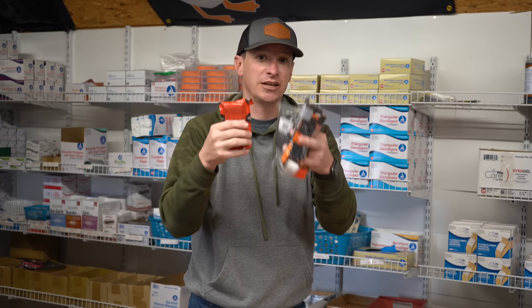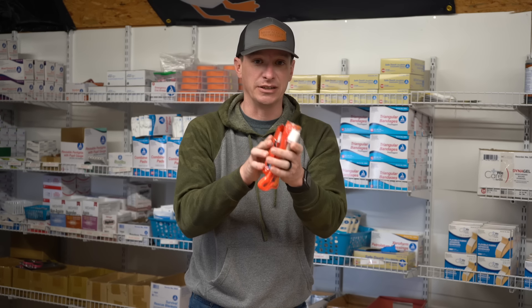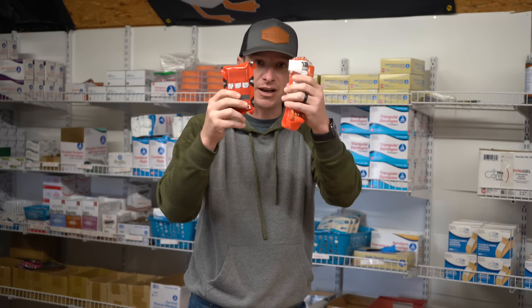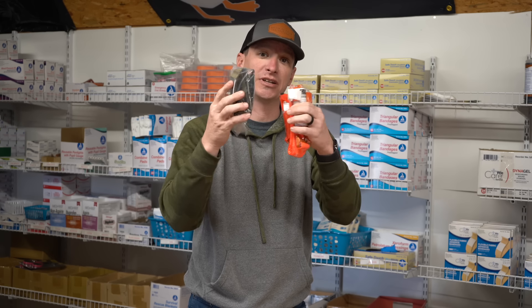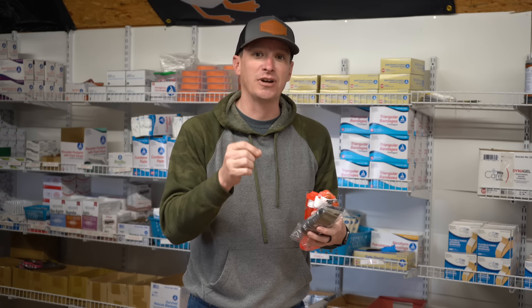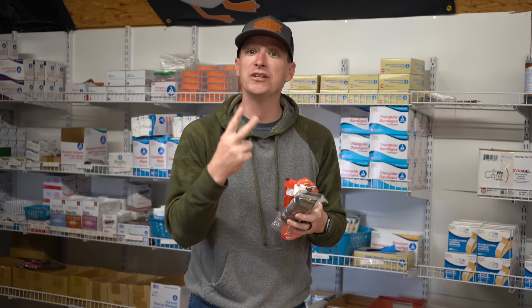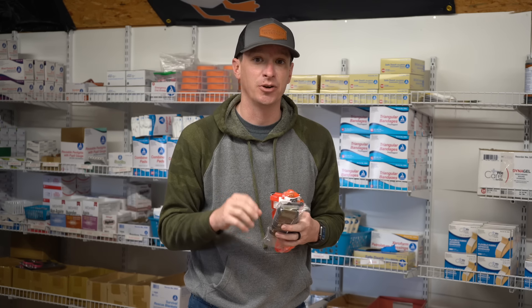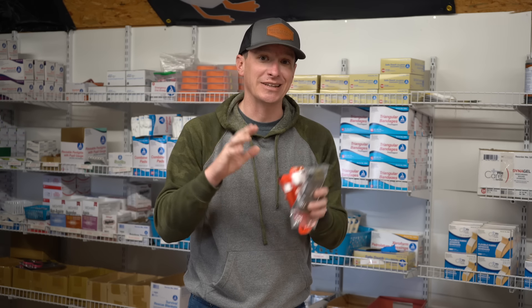Or if you want to run a combo — say a CAT and a SWAT-T — that's fine. The SWAT-T has multiple uses. I think you should put two tourniquets in your kit because sometimes, especially with leg injuries, we need two tourniquets to compress and get the bleeding completely stopped. So the possibility of needing two is there — have two.